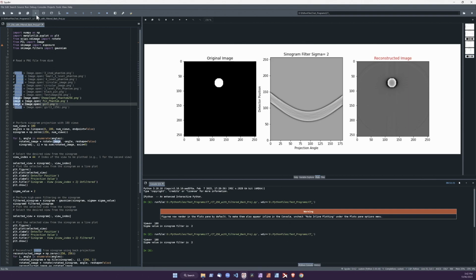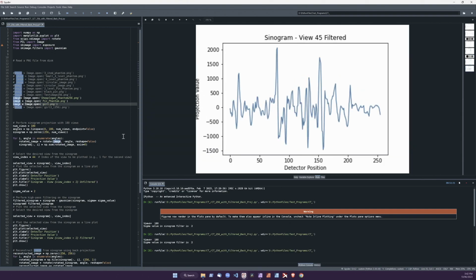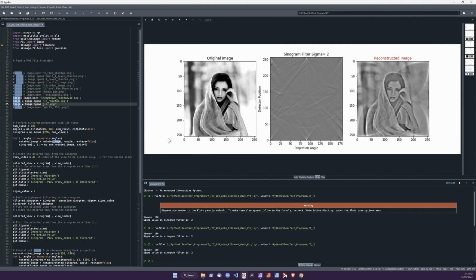The next one, a photograph of a girl, and here it is in all its glory. This is a photograph I obtained off the net, the sinogram of her, and this is her being reconstructed. So the image was taken, broken down into a sinogram, and then the program reconstructed the image from the details that were in the sinogram. And as you can see, there are a few artifacts here, but that's purely the difference between the real world implementation of this software and the actual simulation that I'm using here. As far as I'm concerned, it's doing a sterling job.